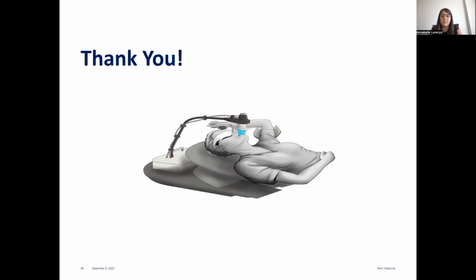I do find that a lot of times patients start to get tired if they're on there too long. The nose clip isn't very comfortable. The treatment position isn't always the best. The mouthpiece to keep that tight seal gets hard. Their mouths get dry. I don't want to say as fast as possible, but you don't want to delay their time on the table any more than it needs to be. Got it.